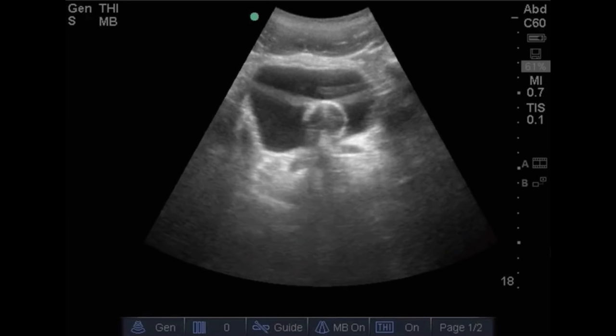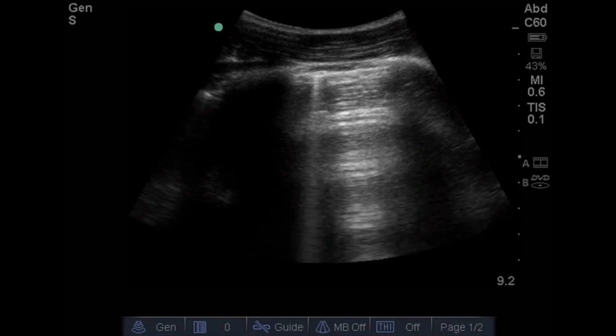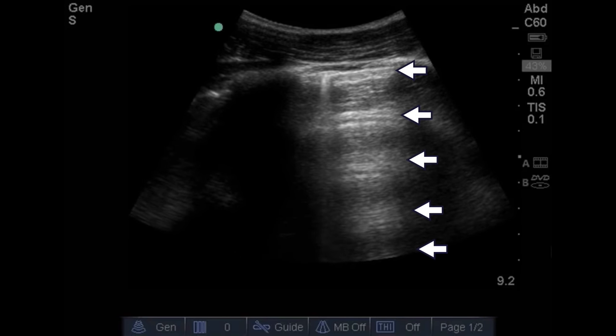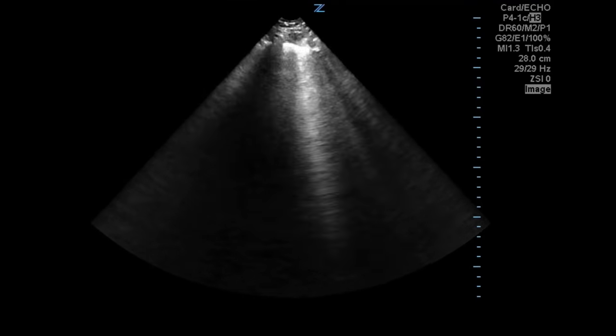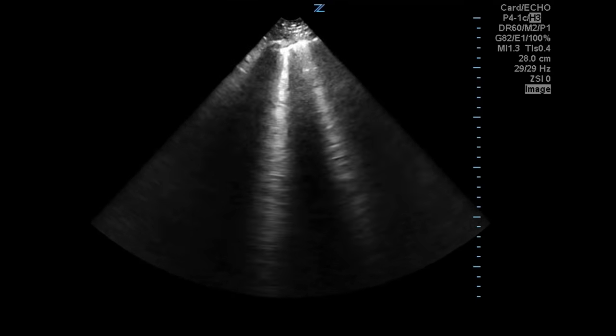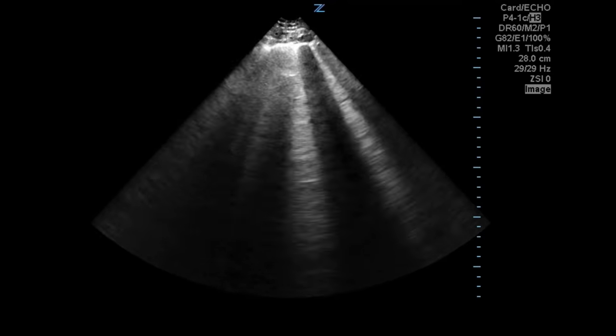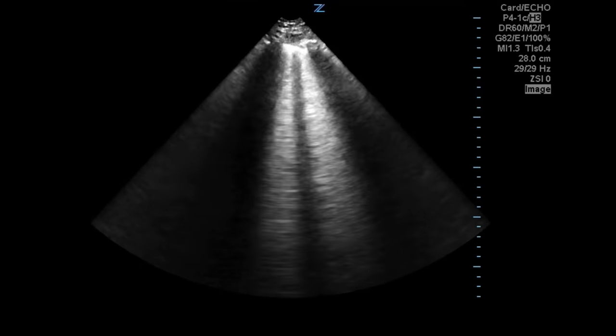Reverberation artifacts occur when sound bounces within tissue due to high reflection, returning multiple signals to the probe. Since the probe assumes sound has traveled in a single straight line, those reverberations are mapped at increasing depth throughout the image. You can see reverberation lines crossing anatomic boundaries in the bladder — a reflection of the probe bouncing off the peritoneum on the anterior bladder surface. The ultrasound beam also reverberates between the pleura and a pneumothorax, and in pulmonary edema, the very narrow space between aerated lung and edematous tissue produces tight vertical reverberation lines called B-lines.